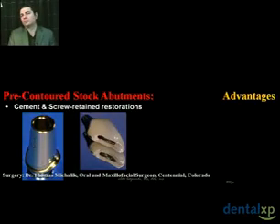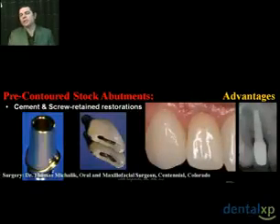If access to the actual screw is toward the lingual, you can provide a patient a conventional screw retained restoration utilizing pre-contoured components. A crown can be fabricated with a lingual chamber, lingual access. The crown is cemented onto the abutment either by the laboratory technician or yourself with Panavia cement, then removed from the cast or removed from the patient's mouth, unscrewed. The margins can then be finished extraorally in your hands, and you'll know then, you're guaranteed that you have no excess margins. You're also guaranteed you have no areas for ingress for bacteria. The restoration can then be screwed back into the patient's mouth.